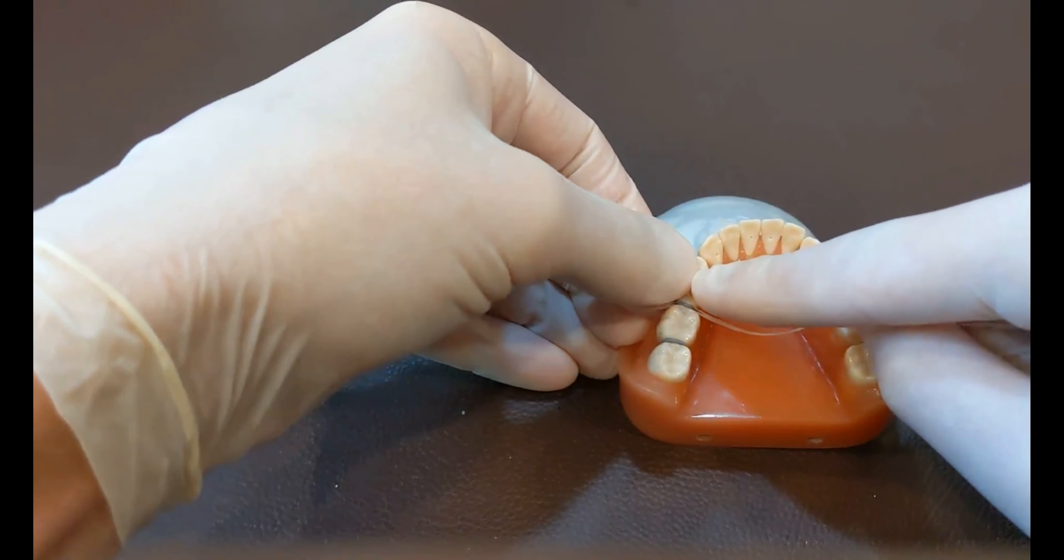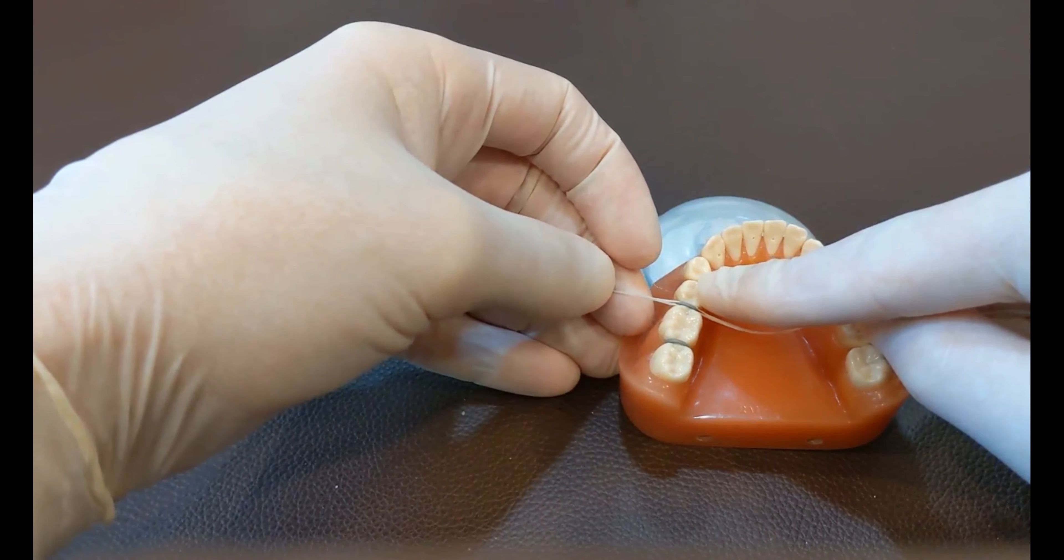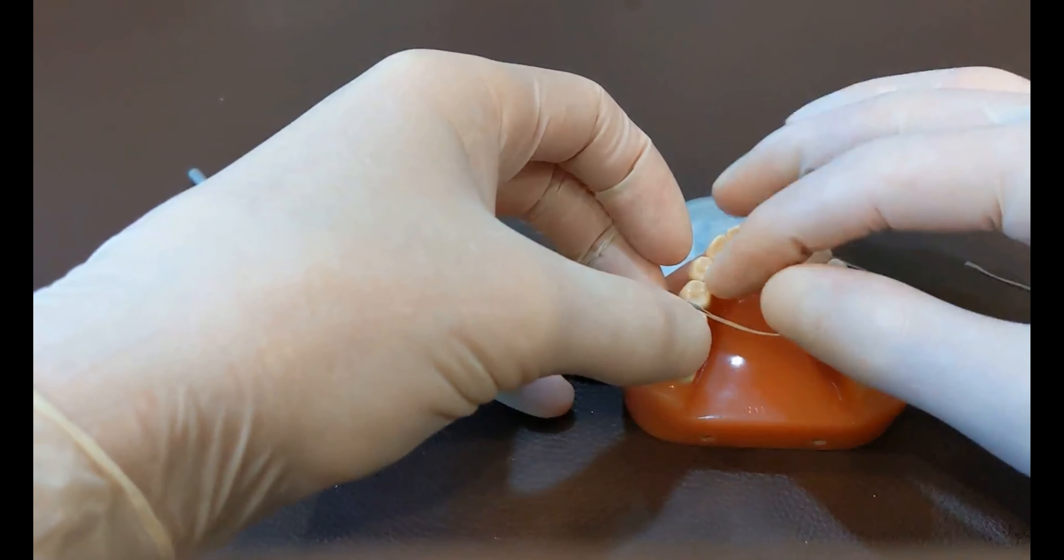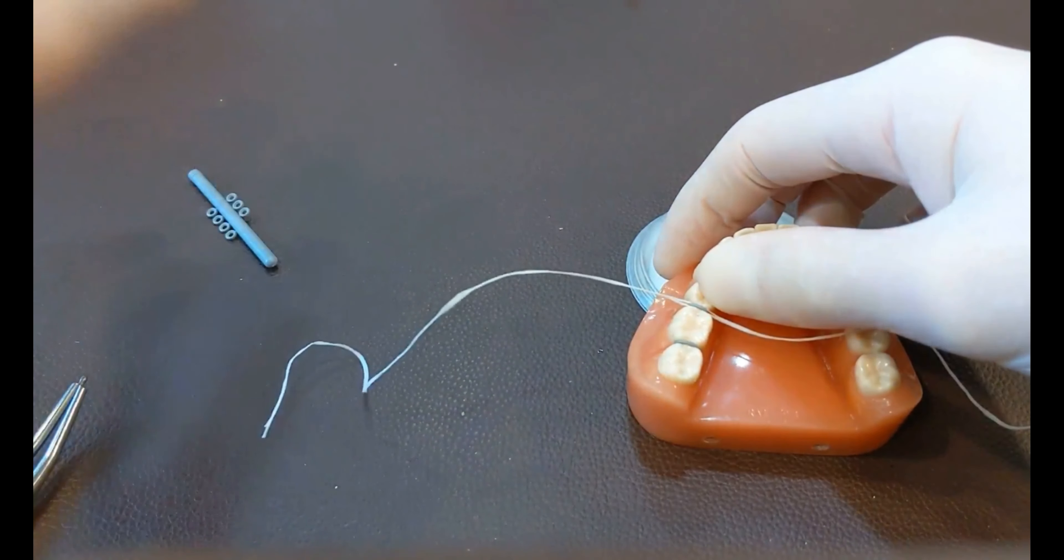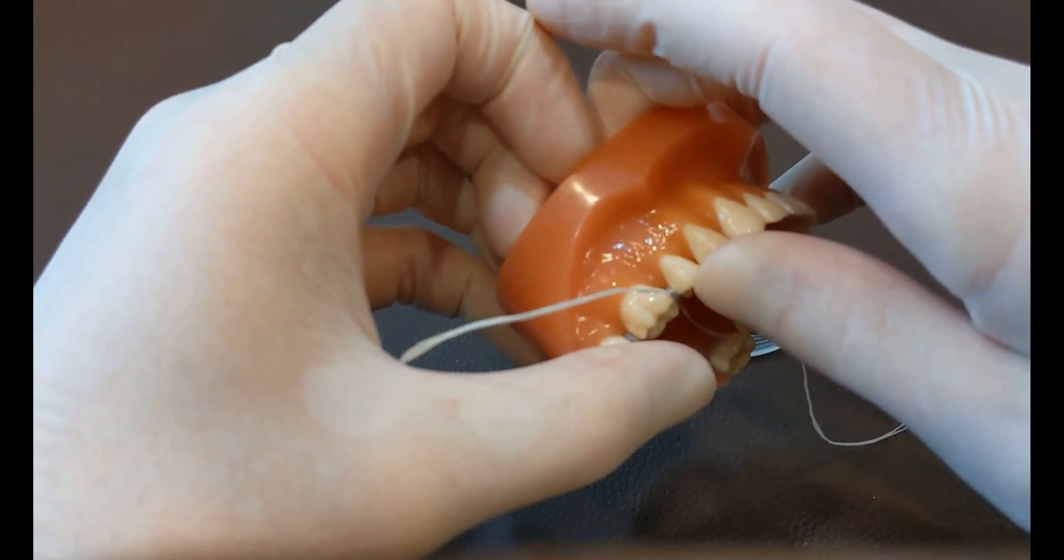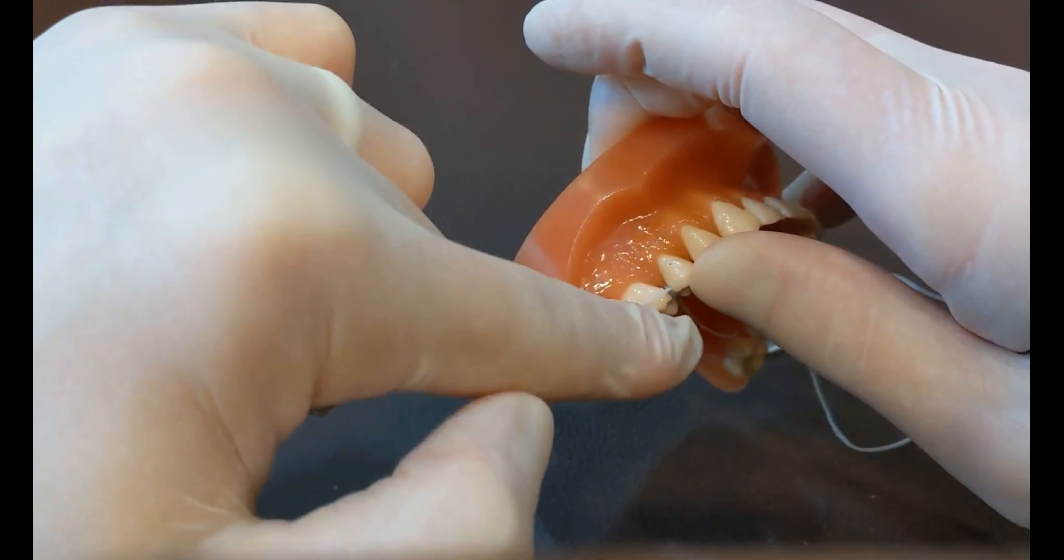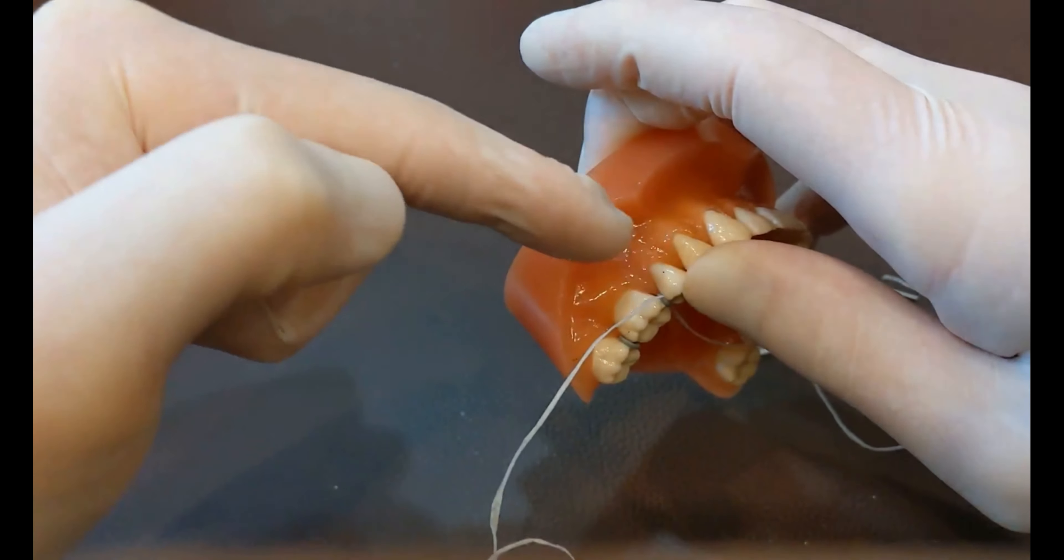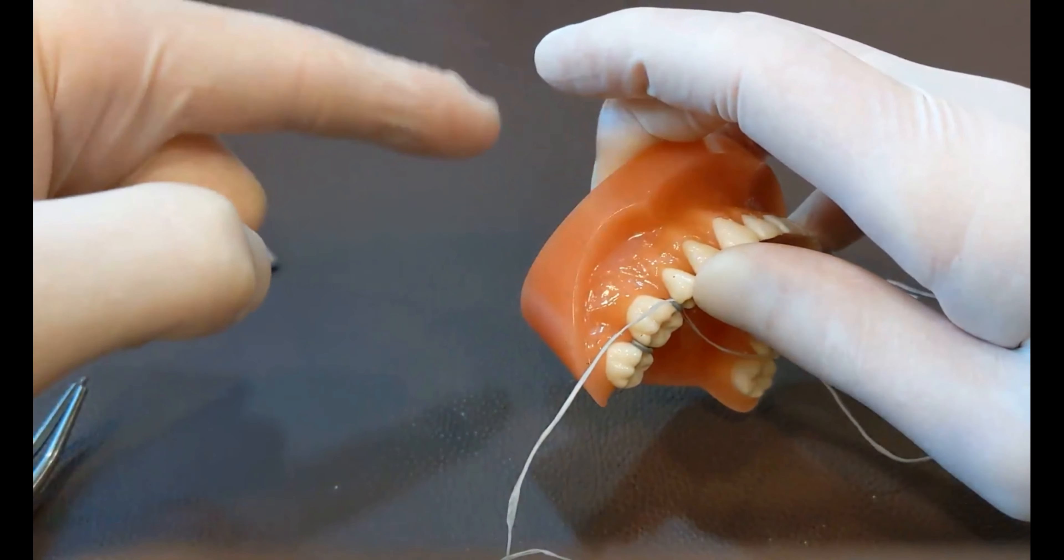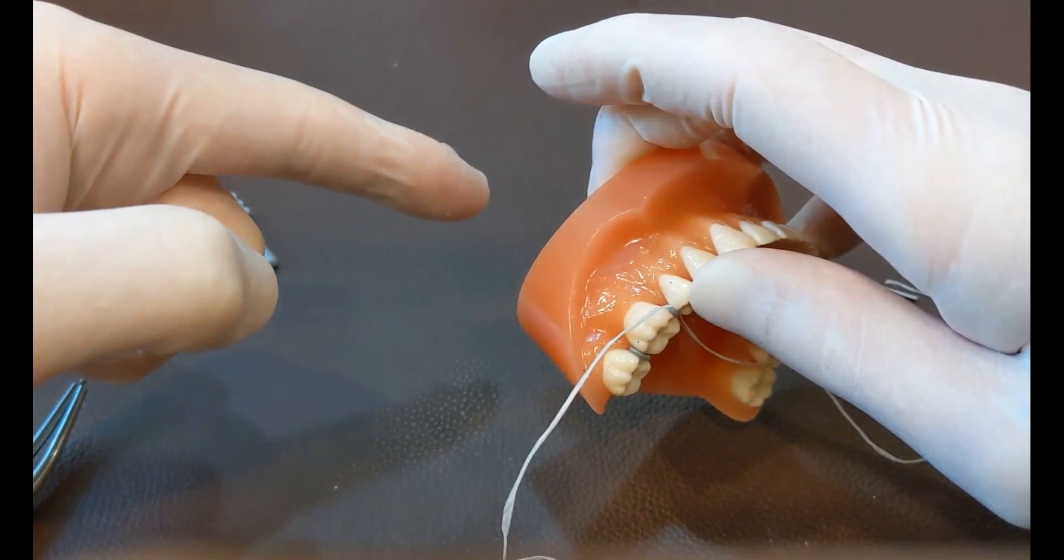This is super loose right here, but in the patient's mouth it won't be nearly so loose. So once you get it to where one part of the loop is above the contact and the rest is down below, so it basically surrounds the part where the two teeth are touching.